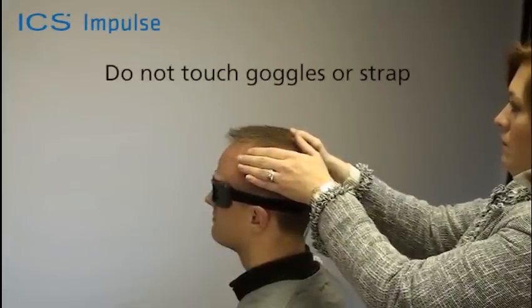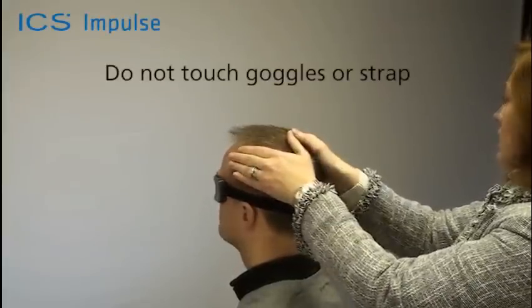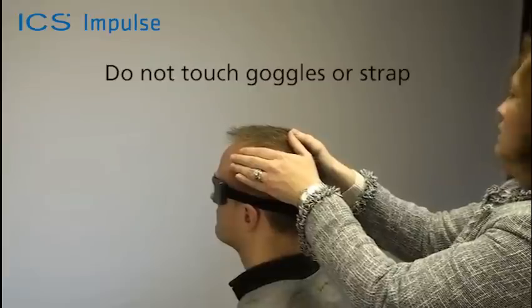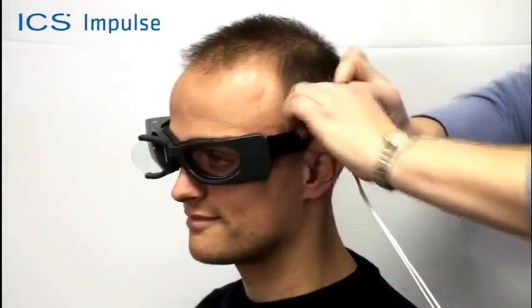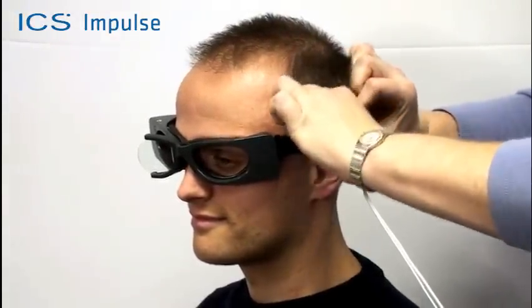Touching the goggles or the goggle strap while moving the patient's head can result in moving the camera, which produces artifacts in the collection data. It is important the goggles are strapped on tight and do not move during testing.